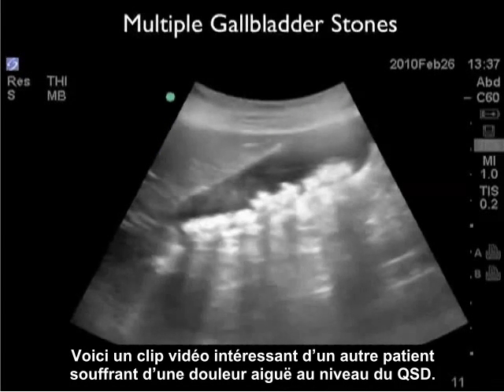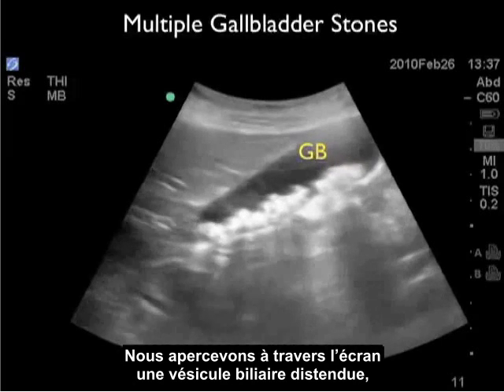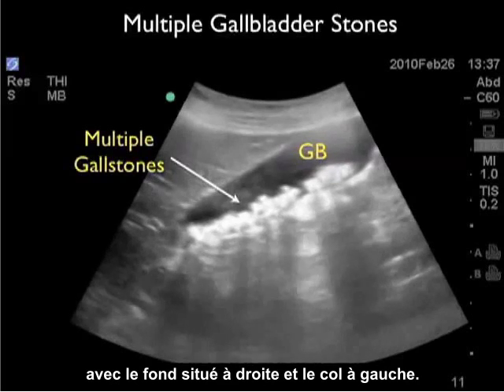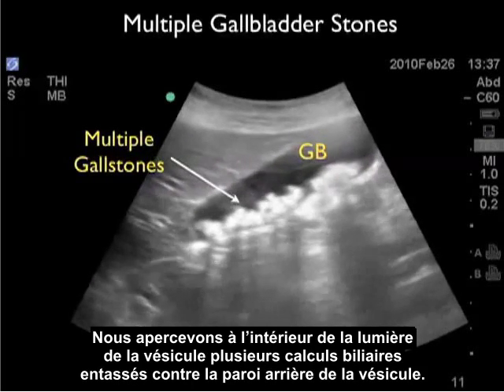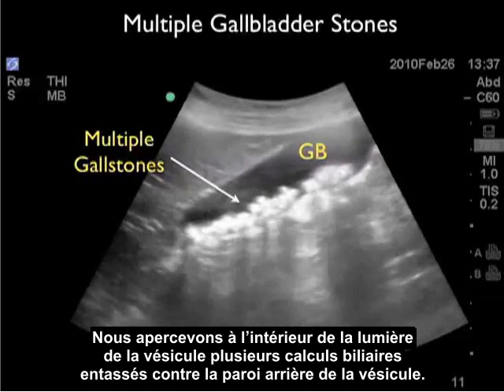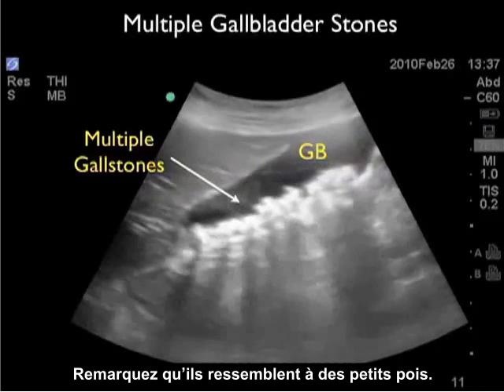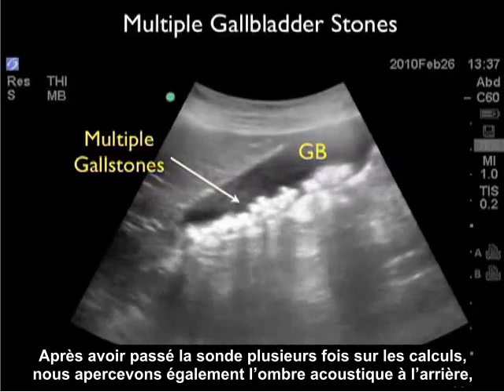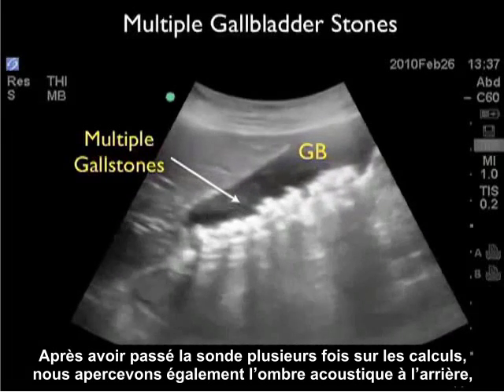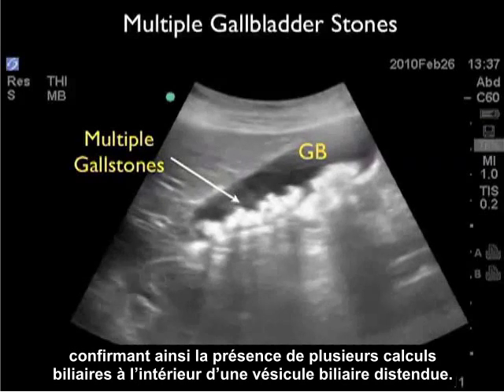Here's an interesting video clip from another patient with acute right upper quadrant pain. We see a distended gallbladder stretching across the screen, with the fundus located towards the right and the neck towards the left. Within the lumen of the gallbladder, we see multiple gallstones layering across the back wall with almost a small pea-like appearance. We can see the posterior acoustic shadowing as we scan back and forth — multiple gallstones within a distended gallbladder.